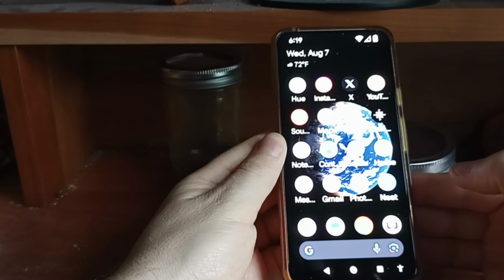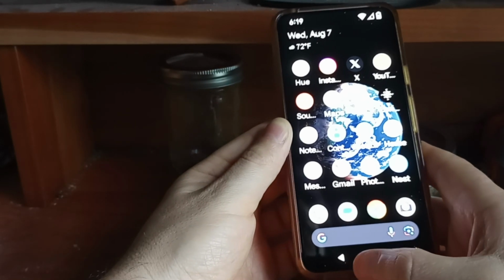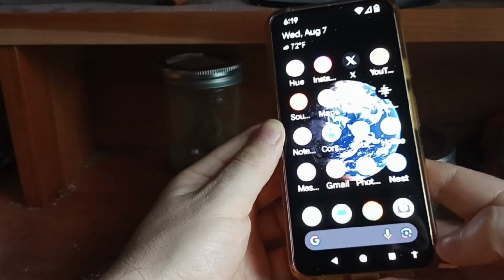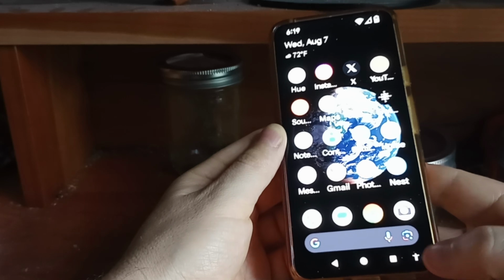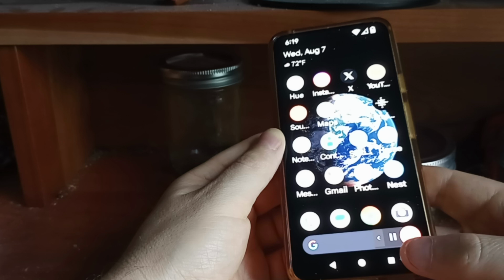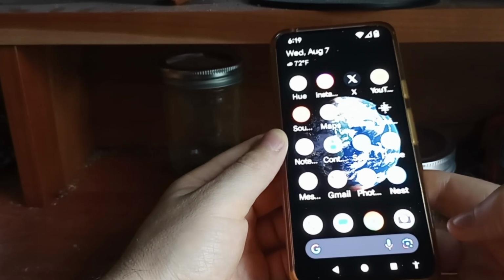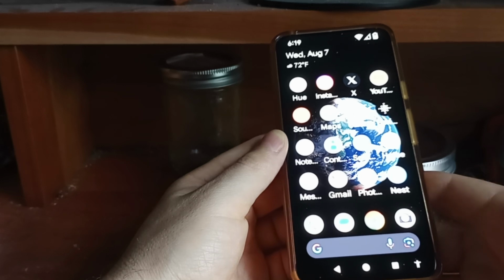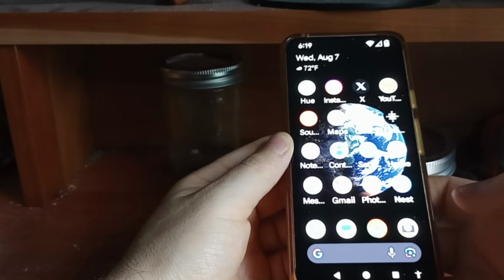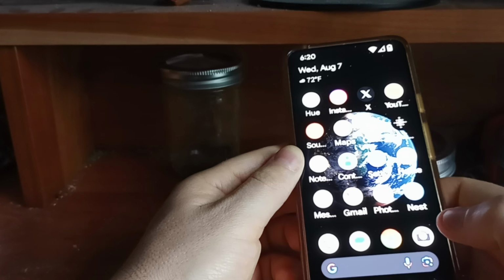So I like to use the, sorry, I'm gonna have to look at my phone. The buttons on the bottom, the old school navigation way. And there's actually a fourth button you can enable in the bottom right here called the accessibility button. So you can press that. Accessibility. And what I have is the select to speak feature, where you can press the accessibility button and then press select text on the screen and it will read it to you. So that's one of the first things to enable.